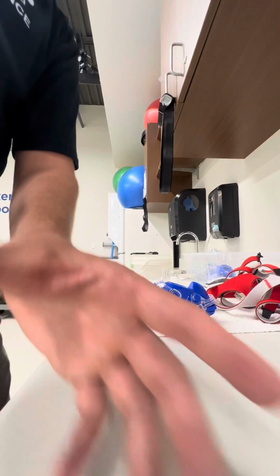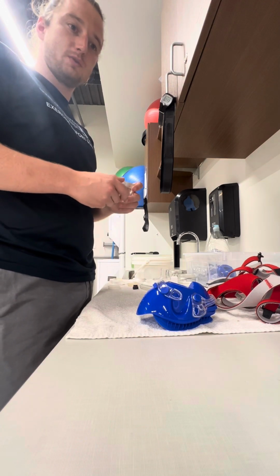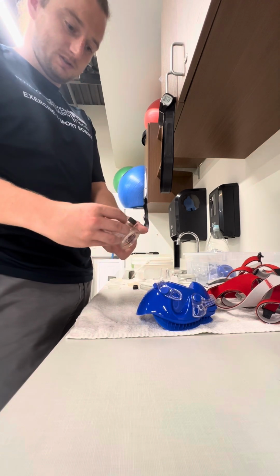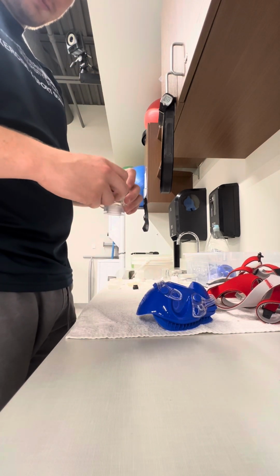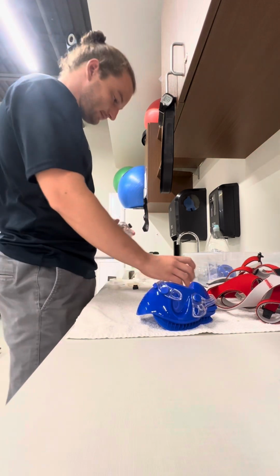Okay, I'm going to demonstrate how to construct a mask for a VO2 max or resting metabolic test. We have our main component piece. We'll put the mouthpiece on. Saliva trap goes on the bottom, opposite of the black piece.